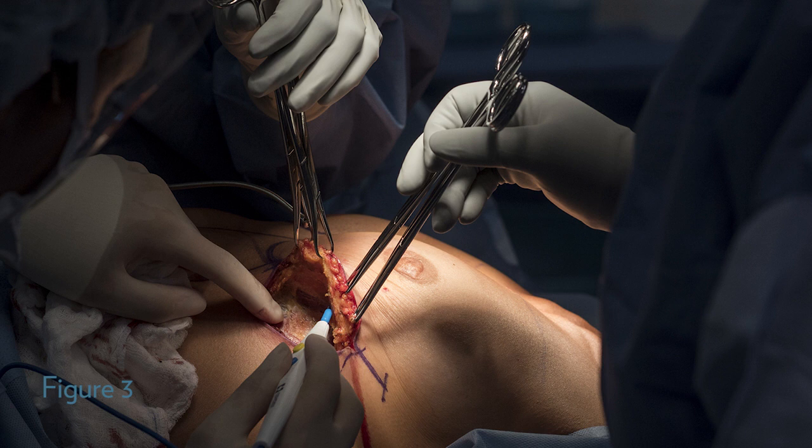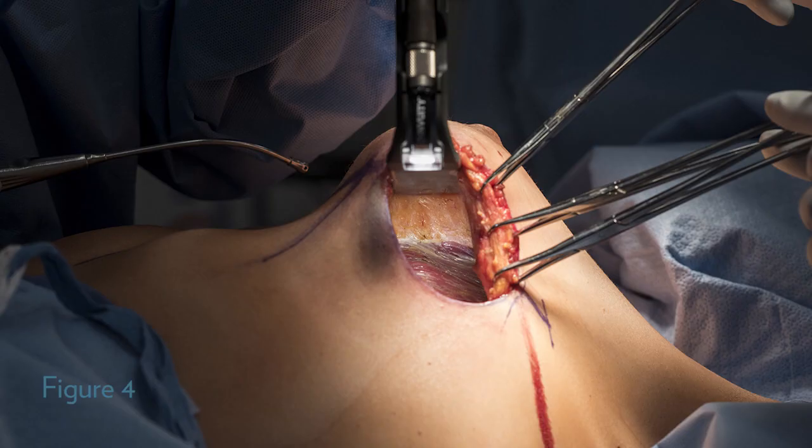As I work laterally I ensure that I preserve the serratus anterior fascia. I continue my dissection to the sternum medially, the clavicle superiorly, and out towards the latissimus dorsi muscle laterally. In figure four you can see the completed dissection of the breast tissue off of the pectoralis muscle. I have taken the pectoralis fascia off of the muscle and the Adair clamps are elevating the skin, the breast tissue, and the fascia superiorly. The black lighted retractor is essential to my dissection because it provides adequate retraction while also serving as a light source.